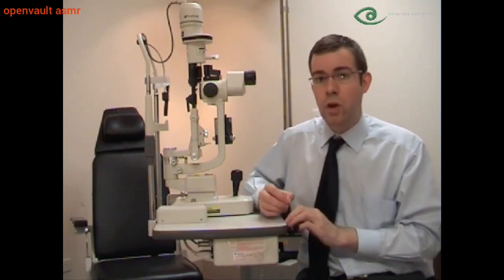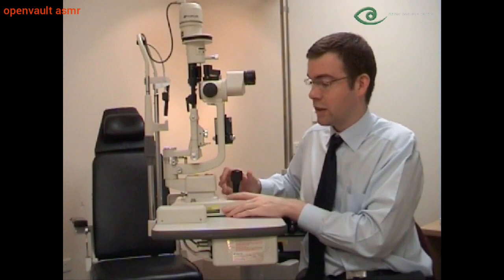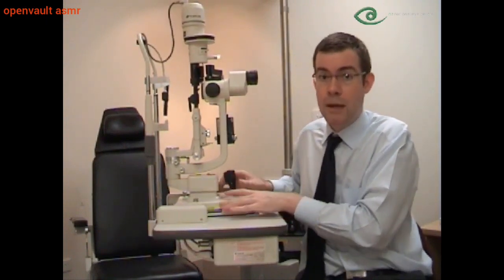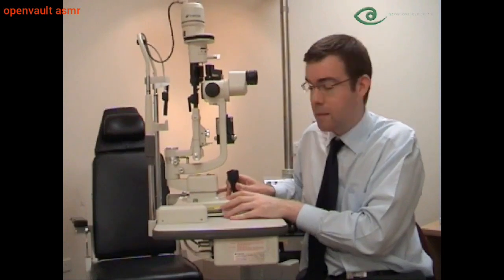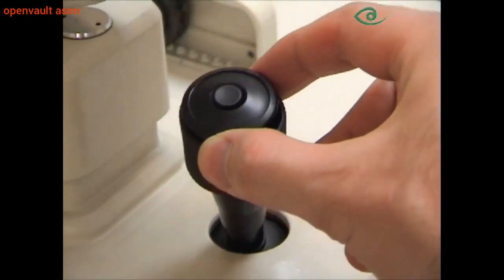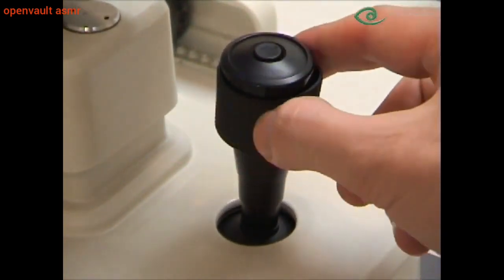In a normal microscope, we focus by moving the stage up or down. With a slit lamp, the patient's eye is in a fixed position. So to focus, we move the slit lamp either away or toward the patient. We can make gross movements by moving the entire slit lamp, or make very fine adjustments by using this joystick. Rotating the top of the joystick moves the slit lamp up or down.